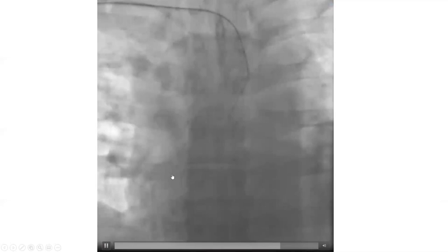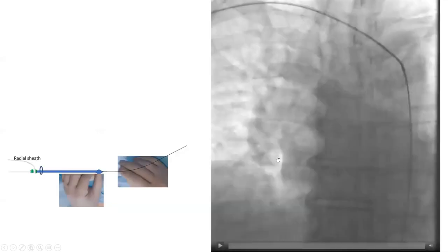Here's another illustration of another case. It was in the descending. We're pulling from the descending with a counter-clock maneuver — it jumps into the ascending. Then you advance the wire and loop it over the aortic valve. We're using JL4 here, but it's the same maneuver with any catheter you're using.